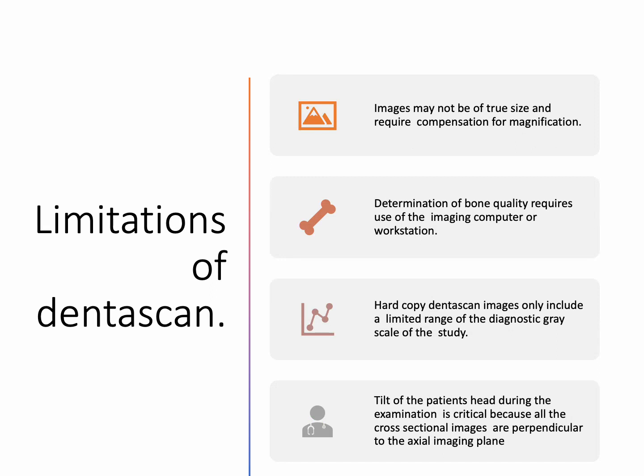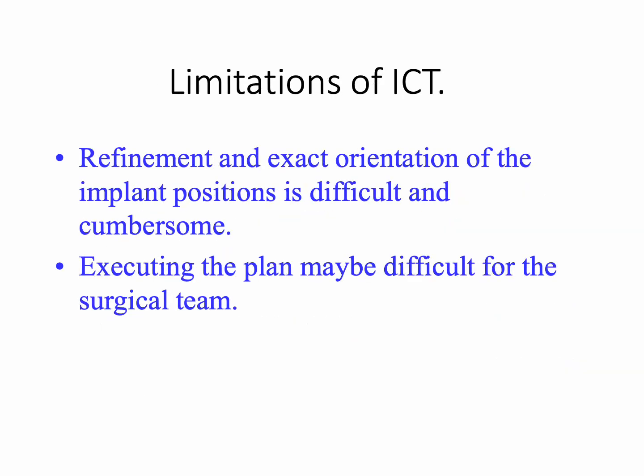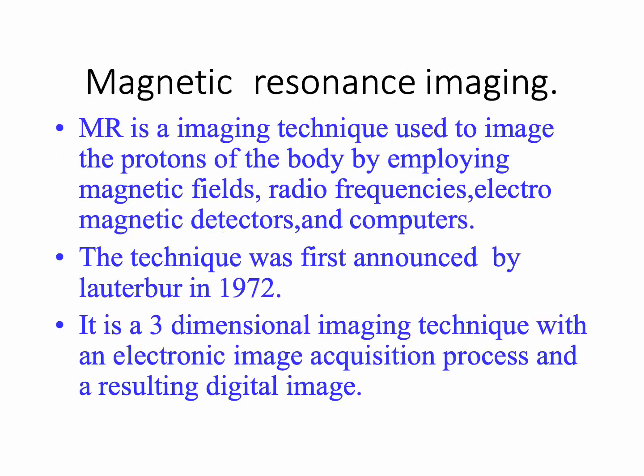Determination of bone quality requires the use of imaging computers or workstations. Hard copy Dentascan images only include a limited range of diagnostic scale, and the tilt of the patient's head during examination is critical because all the cross-sectional images remain perpendicular to the axial imaging plane. ICT is interactive computed tomography, which was developed to overcome the limitations of CT. The limitations of ICT are, however, that the refinement and exact orientation of implant placement might be cumbersome and difficult, and execution of the plan might be difficult.